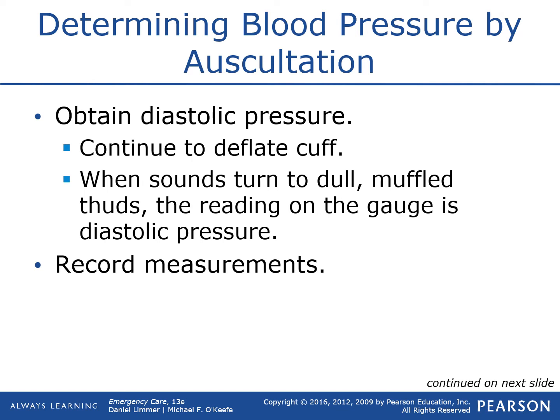You're going to continue to listen and hear that heartbeat until you can't really hear any sound anymore. The textbook definition is you listen for a change to a dull, muffled sound, so there's a slight change in the sound. That really happens maybe 5 to 10 millimeters of mercury before you lose the sound altogether. So for most people, especially in the back of a moving ambulance where it's hard to hear very fine changes, it's okay to just listen until you can't hear the heart beating anymore.